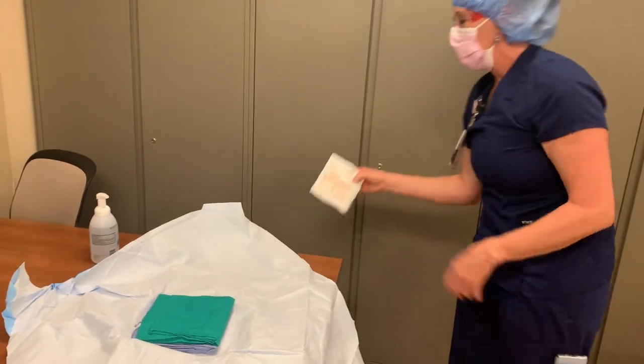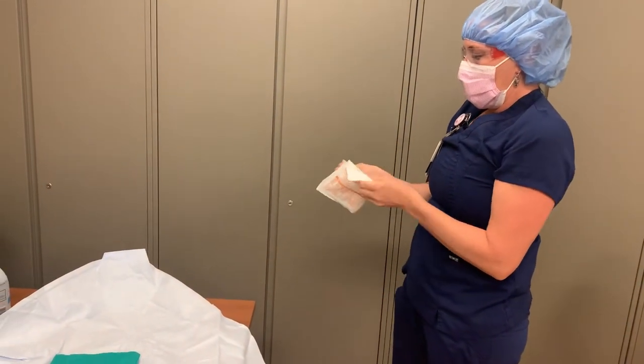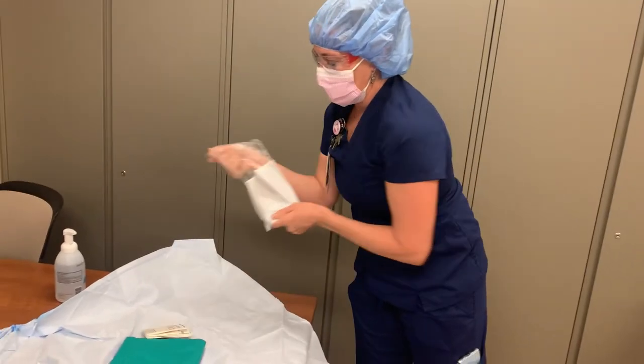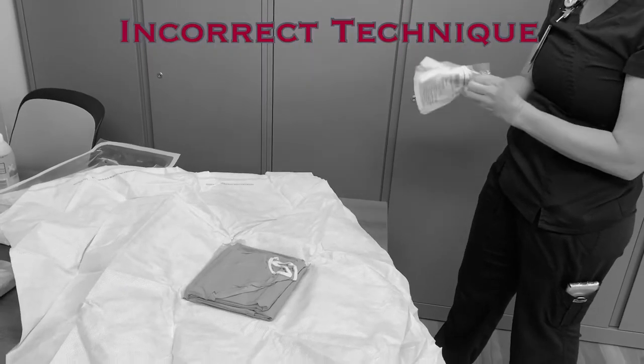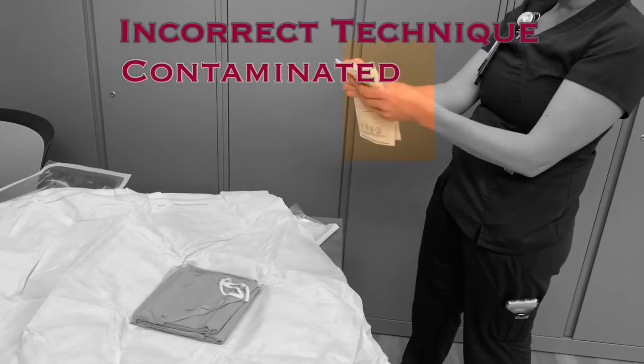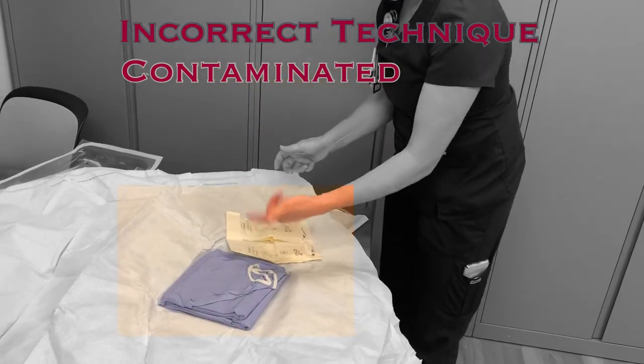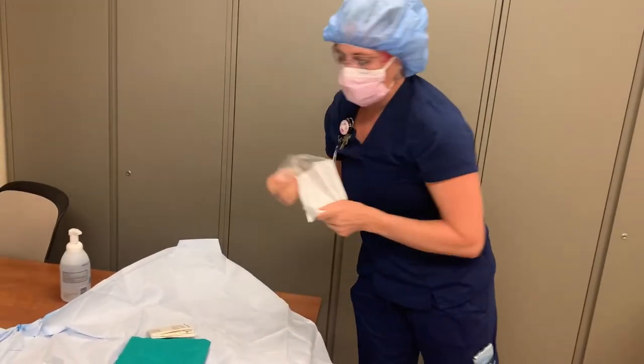With your field open, open one of the packages of sterile gloves. Drop the sterile inner wrapping and gloves onto the sterile field, and dispose of the outer wrapping. Do not handle the sterilely packaged inner wrap prior to dropping it on the sterile field. When you touch the wrap, it is contaminated, and anything that this wrap touches will also be contaminated. Simply drop the gloves onto the field.